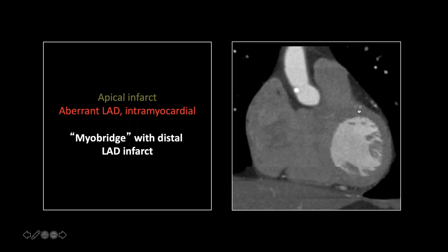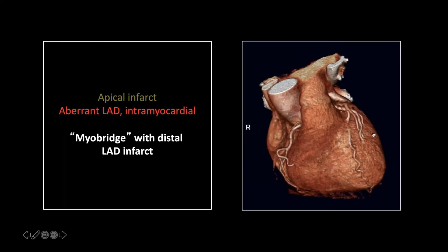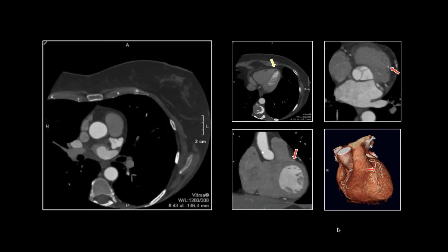This is what's called a myobridge — it's more apparent right here. The early segment of the proximal LAD is dipping down into the myocardium itself, instead of sitting on top of it like a good coronary should. This is one of those rare instances where the surface-shaded display really helps you — you can see it diving down into the substance of the myocardium. That short segment is obviously at risk: every time the heart contracts, that myocardium surrounding that coronary is contracting on it and pinching it off.